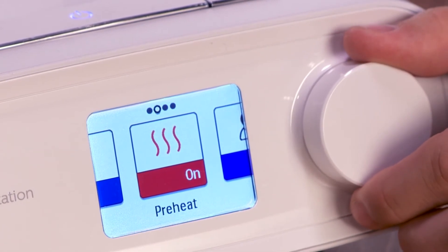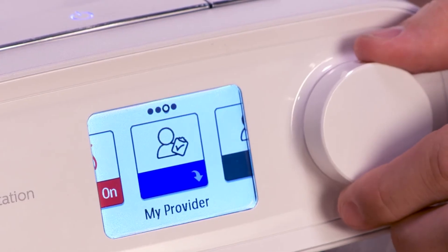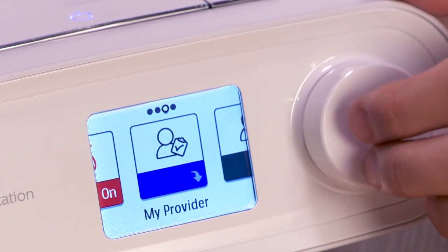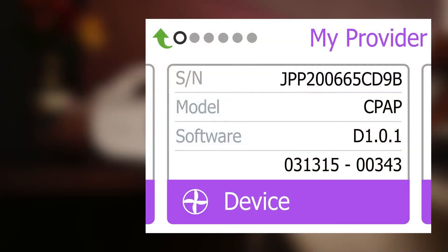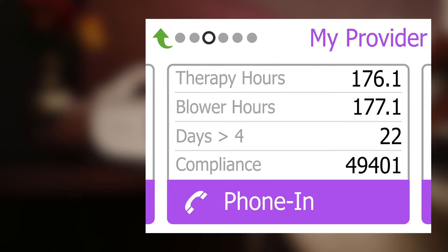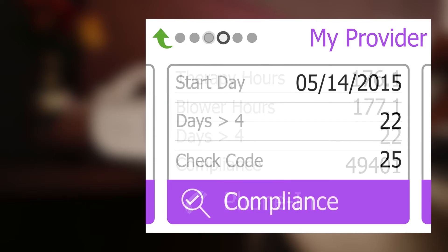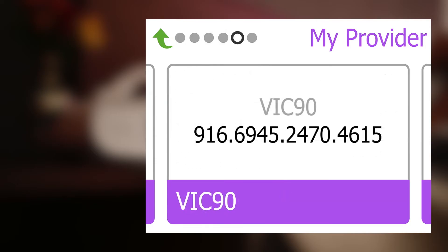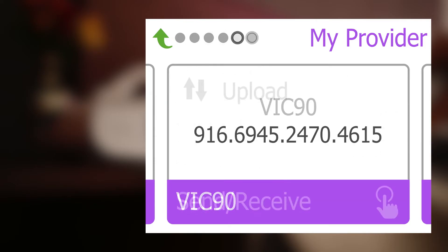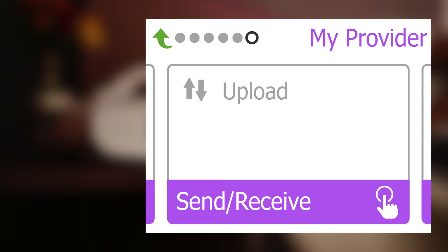The My Provider menu contains information that your provider may ask you to read to them so they can better assist you over the phone. This section also includes the modem upload and performance check screens.